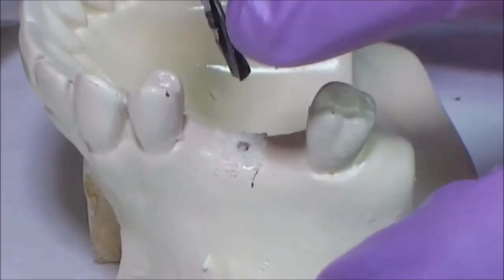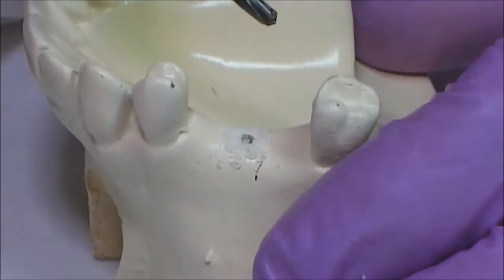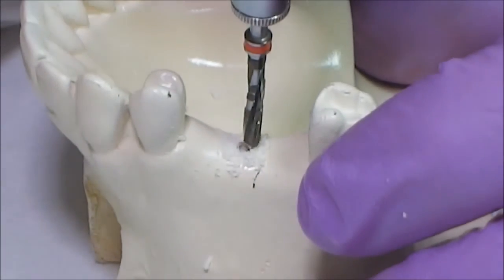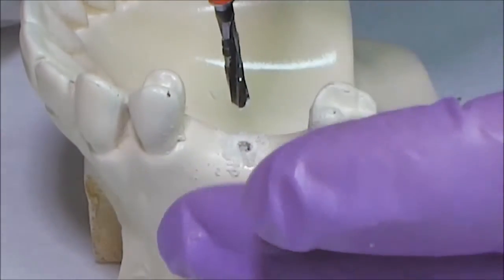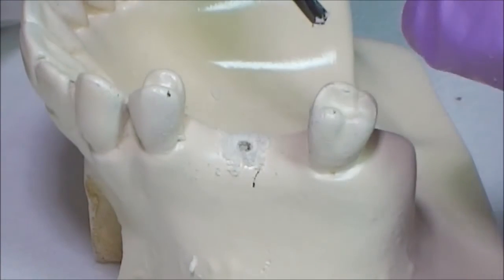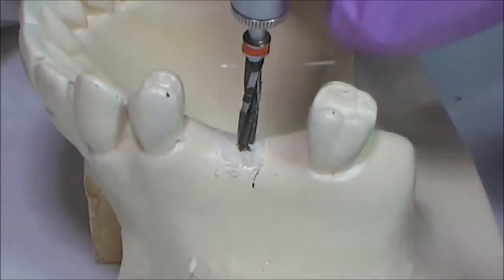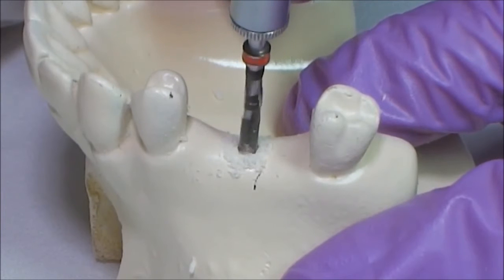The next drill is 2.8 millimeters in diameter. With every subsequent drilling, we decrease rotations by 100 to 200 units. Drilling is started and stopped outside the bone; otherwise the drill can be damaged. We draw attention to the pressure: it will be very high when passing through the top layer of compact substance. At later stages, the spongy substance will tighten the drill during rotation — therefore, we may press a little during drilling in surface layers, and conversely, hold back in the spongy substance.